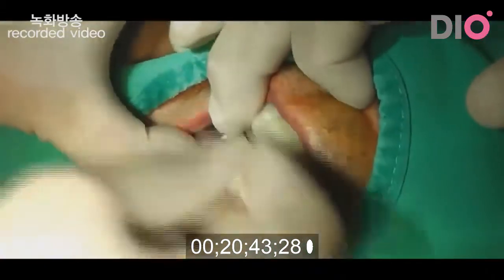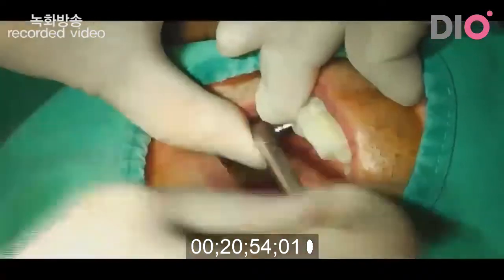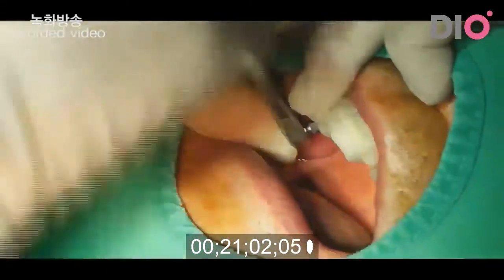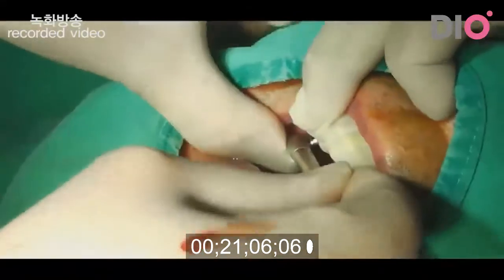You can see the stability of the implant. I can feel the stability of the implant already. Now I control the depth of the implant.